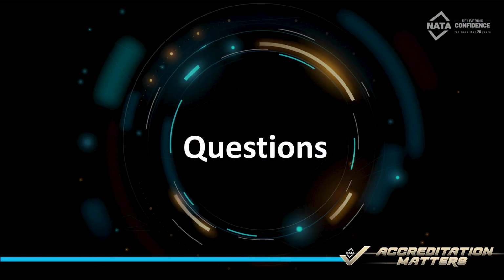So Andy's asked, do LIMS systems, which include clinical comments or flag abnormal results, constitute an IVD? No. If it's a LIMS where you've got your reference range of results, and it's just flagging whether it's in or outside, that doesn't meet the definition of a medical device. It's when you're adding additional interpretation, particularly where you've got auto release of results where there's not a scientist.